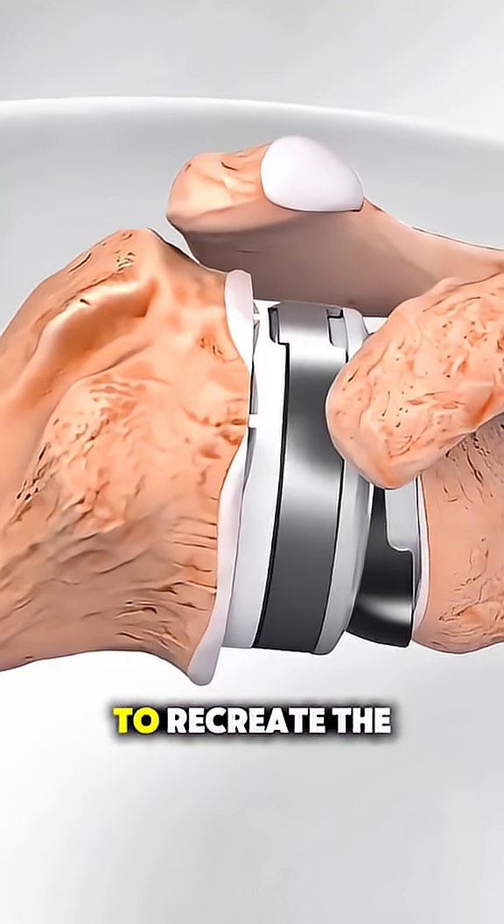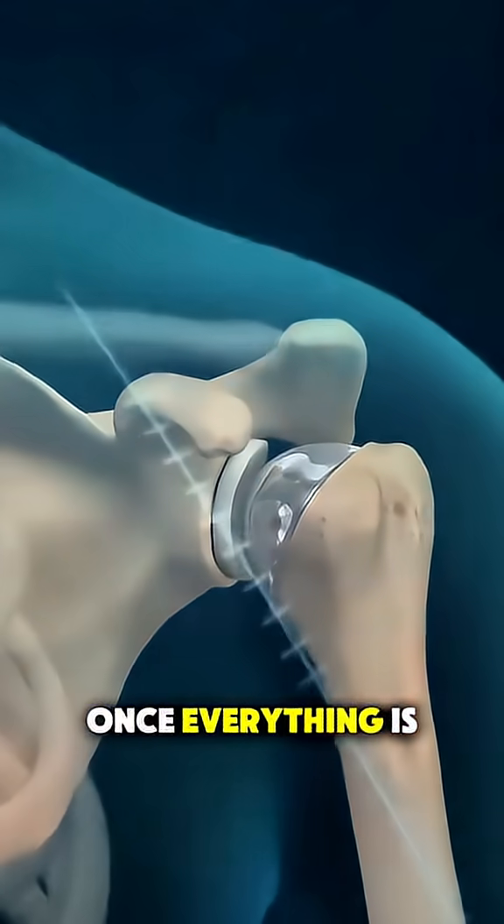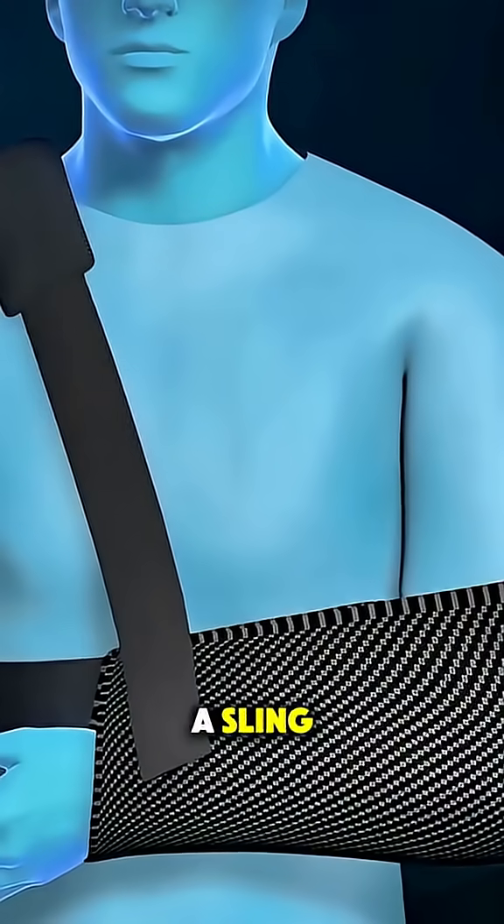These new parts work together to recreate the natural movement of the shoulder. Once everything is perfectly aligned, the surgeon closes the incision and the arm is placed in a sling.